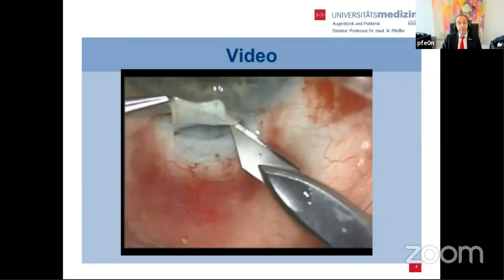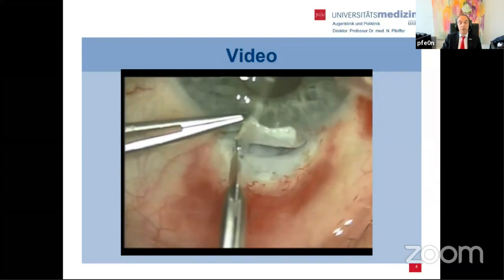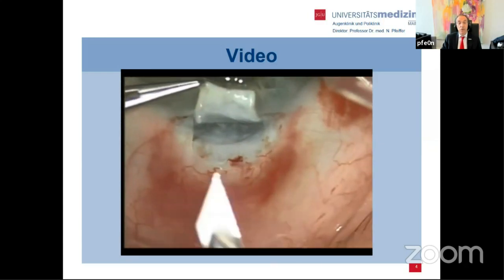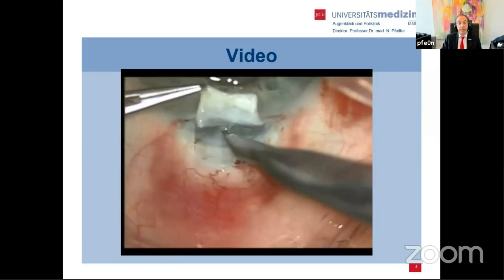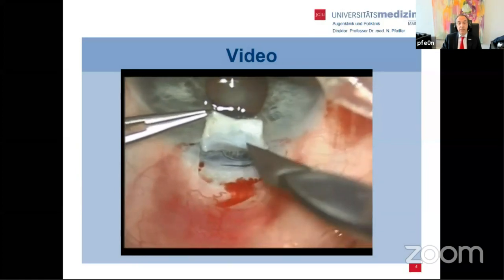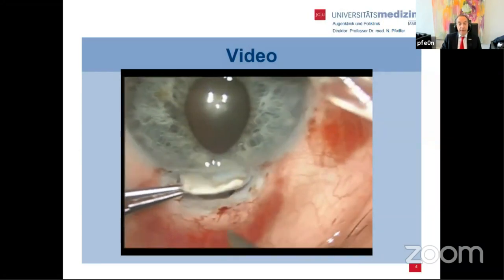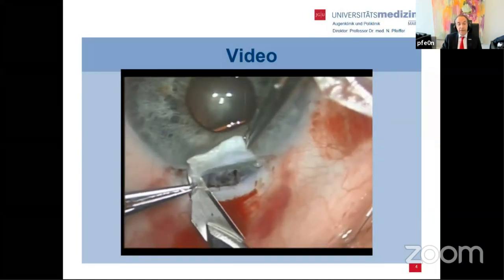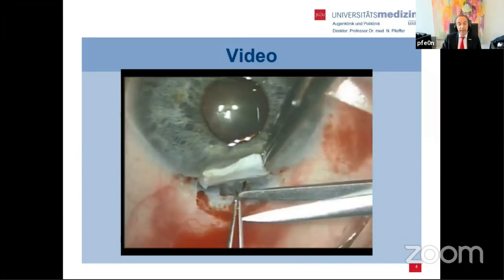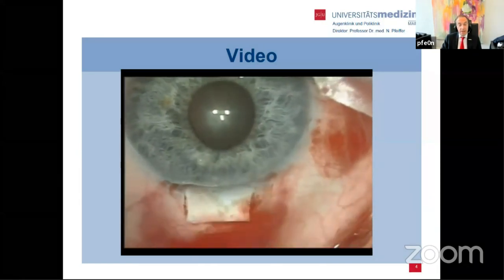So then I take that preparation very far anteriorly because I don't want to do a trabeculectomy. I don't cut out the trabeculum. What I want to do is to do a clear corneectomy. Here's the trabecular meshwork. So this is the first incision far more anteriorly. And the second one is close to the trabecular meshwork. So take out that. As a matter of fact, only in 1/3 of cases I see trabecular meshwork in the specimen. Then I always do an iridectomy, close the scleral flap.